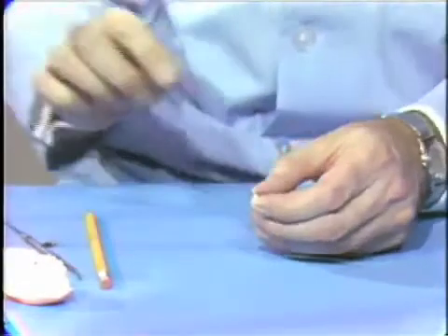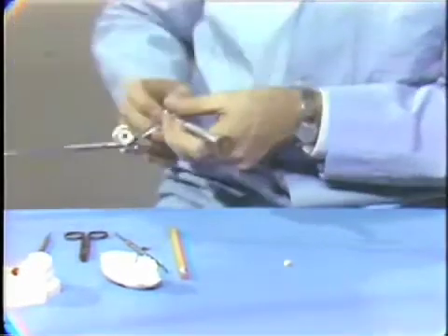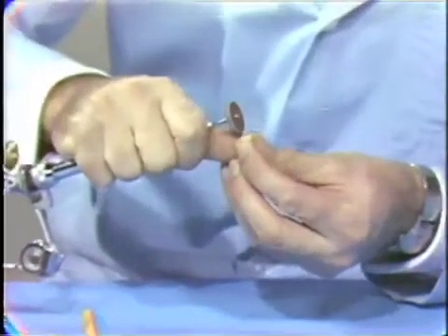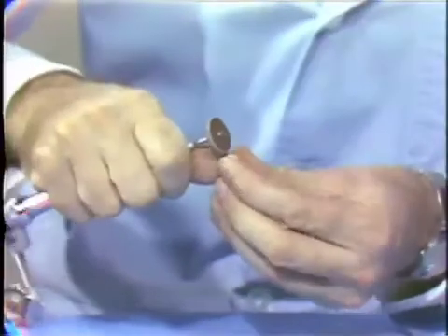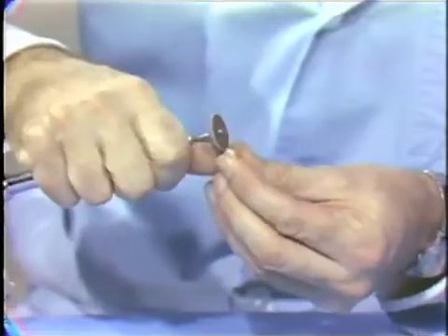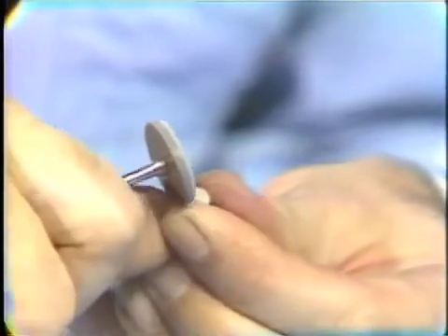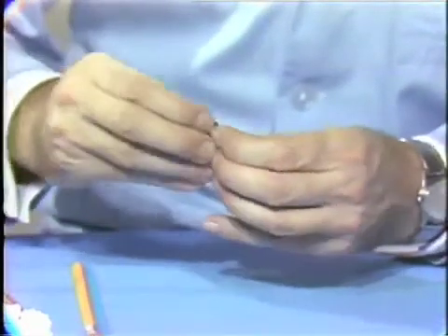Now it isn't necessary to have this polished in the sense that the exposed surface is of porcelain now, because this is going to be covered over, but you do want to have it smooth because you're going to be waxing against this, and it'll facilitate the waxing procedures. So having cut that with a carborundum stone, which leaves a fairly rough surface, it's a good idea to go around with the Cratex medium grade rubber wheel and just smooth over those bevels on there so that they'll be easier to wax to, and that's what I've done now. That has to be done, of course, before the backing is adjusted.